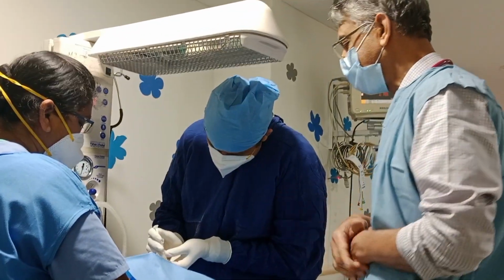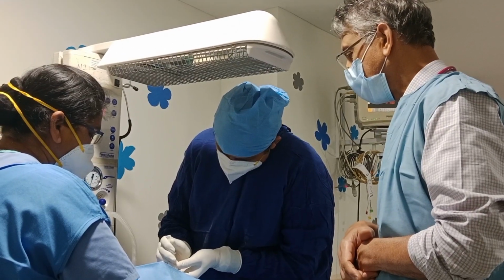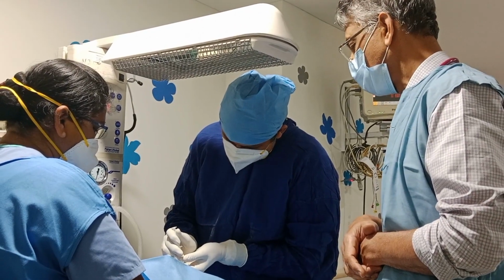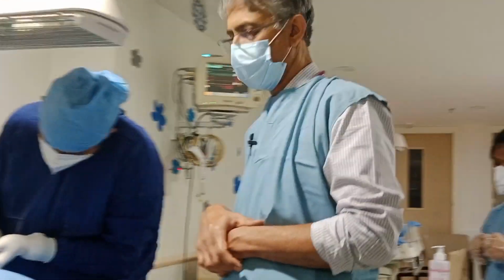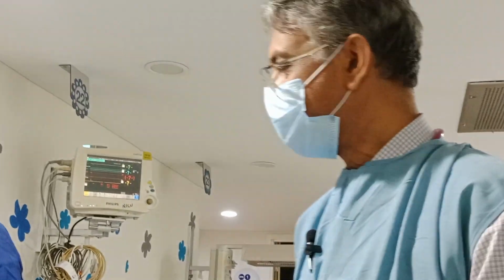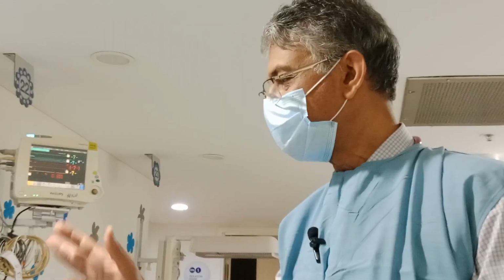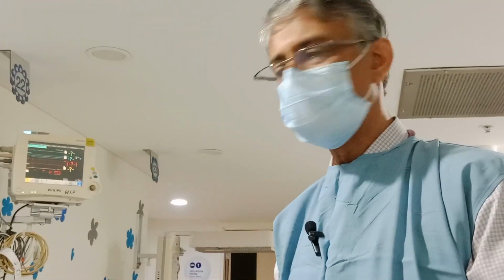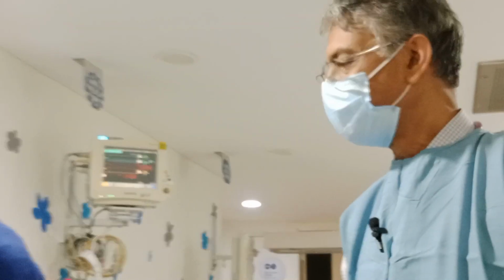And this is the second time you are doing lumbar puncture in prone position. Any concern for flow? Not there, because it comes very nicely. Great, very nice. So this is the second time you are doing lumbar puncture in prone position successfully. Very easy to do and very comfortable to all three people here, the baby, the nurse, and the doctor. Thank you so much.